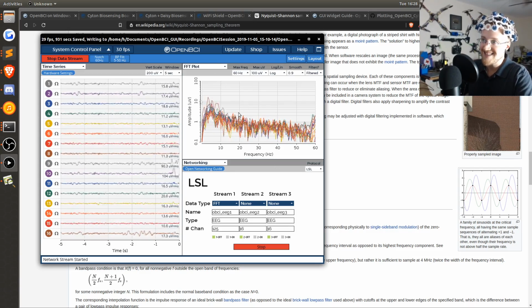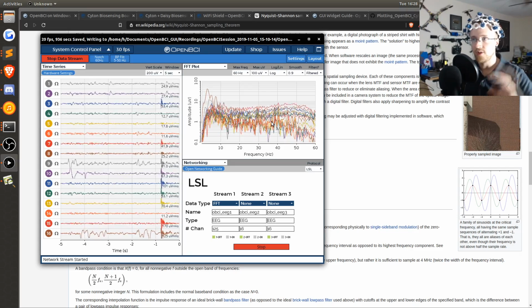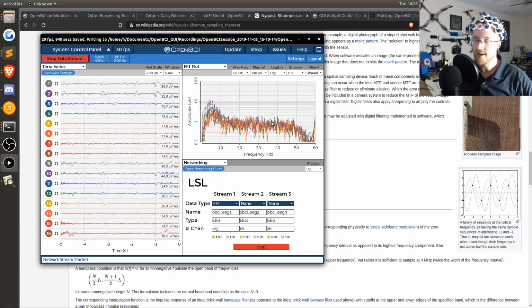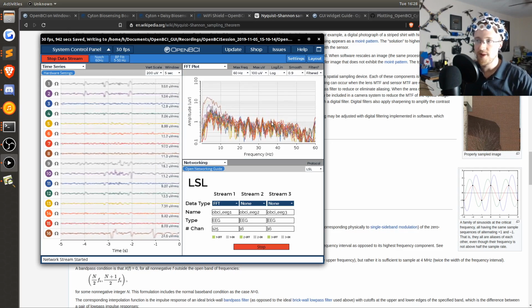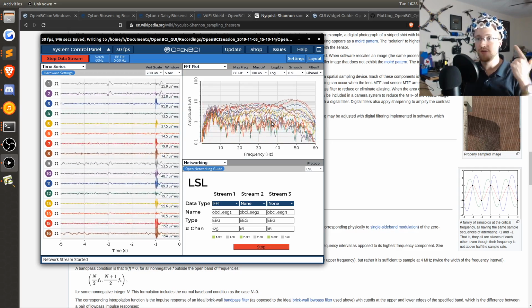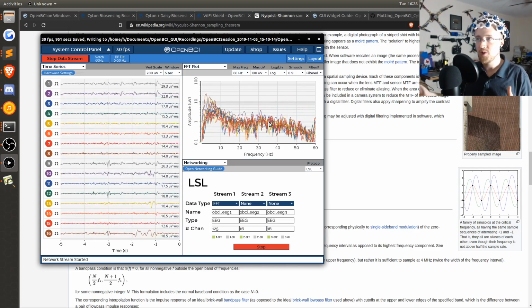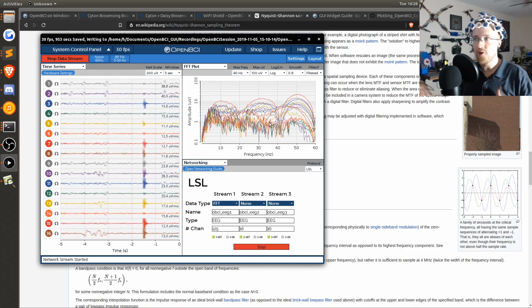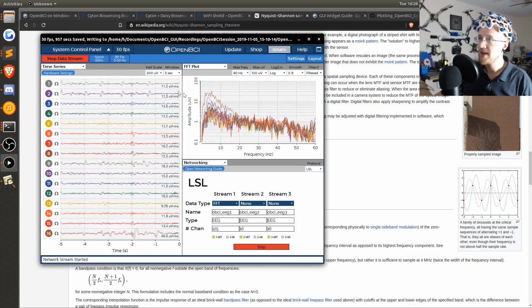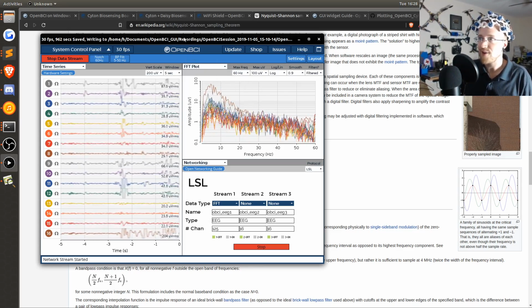So I need this right here, and I could do it, and there's lots of sample code online to do it. There's two major issues. One is just speed. You need to be doing it at a pretty high rate. And two, the same thing as before, I can't really validate code that I don't know how to validate, right? So that's a problem moving forward. So really what I want is this. I just want this graph, right?